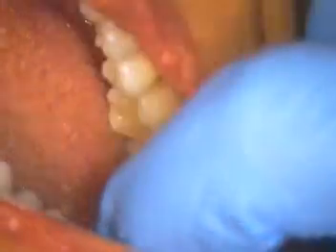And it's all tucked in nice. I think we'll have a nice result here. All right, checking clearance, all important. Clearance closed down all the way together. Stay closed. Now this tab is 1.5 millimeters thickness, so we're gonna put that right over the tooth, bite down again, all the way. And that floats in beautifully.